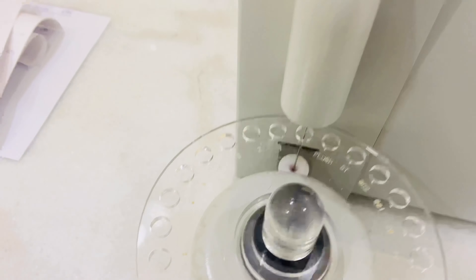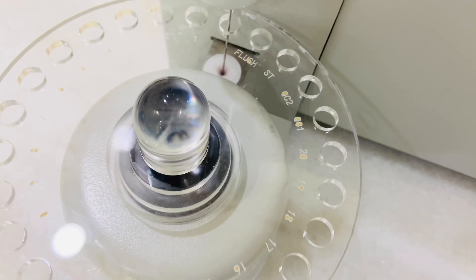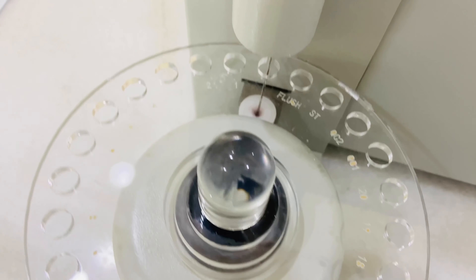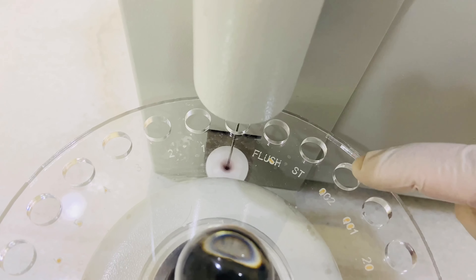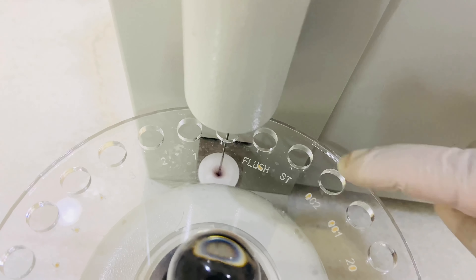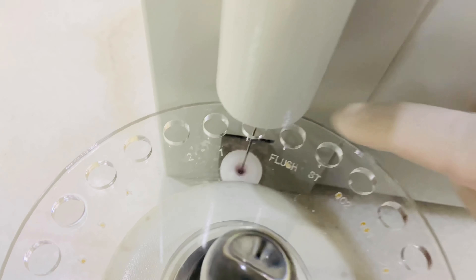Option number two is 'Analyze Batch Sample.' Clicking it asks about the positions. For example, if I have 10 samples, I can mention the range from position 01 up to 10, then click 'Yes' to start running the batch.